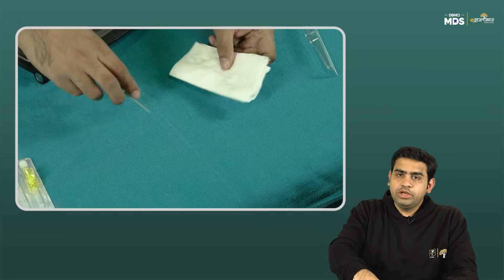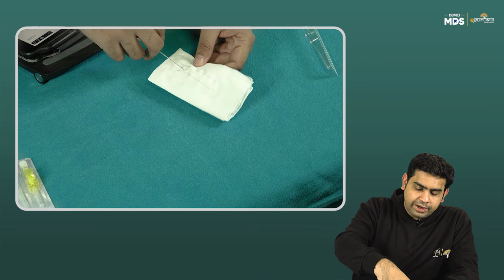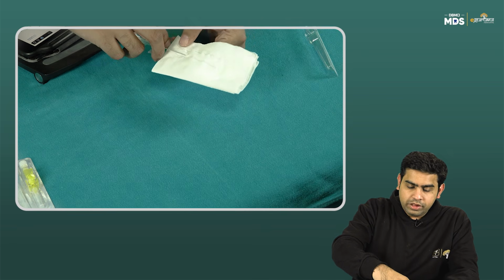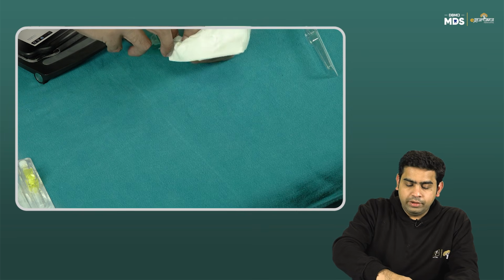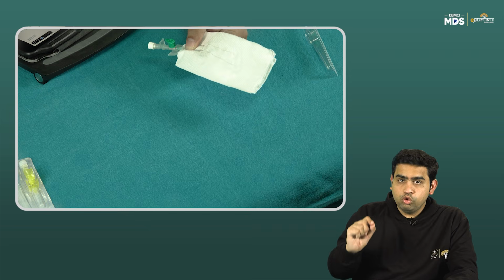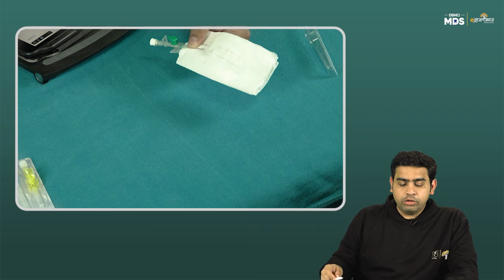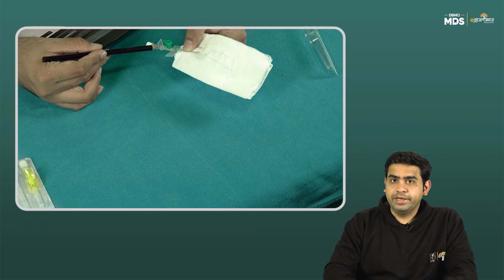So you need to gauge it. You need to enter one part of the lumen of the vessel, and now you have to be parallel and go in. If you are properly inside that particular vessel, the blood will come and get collected over here till here.